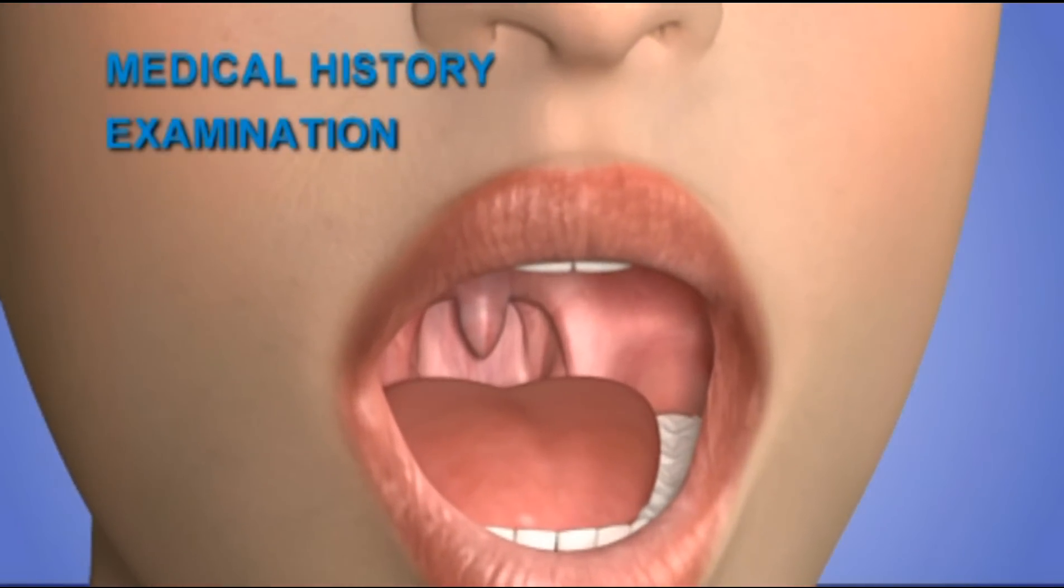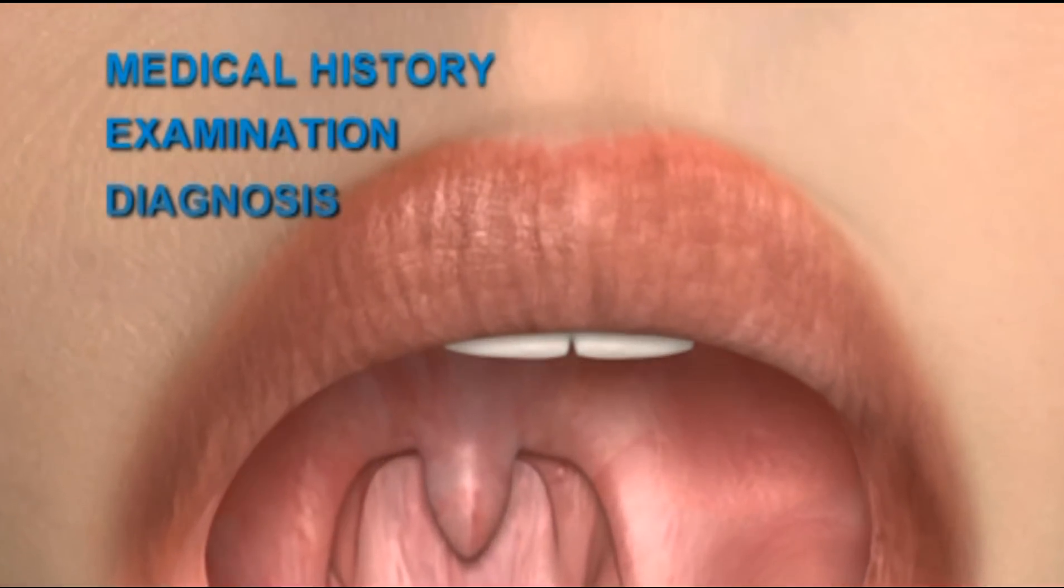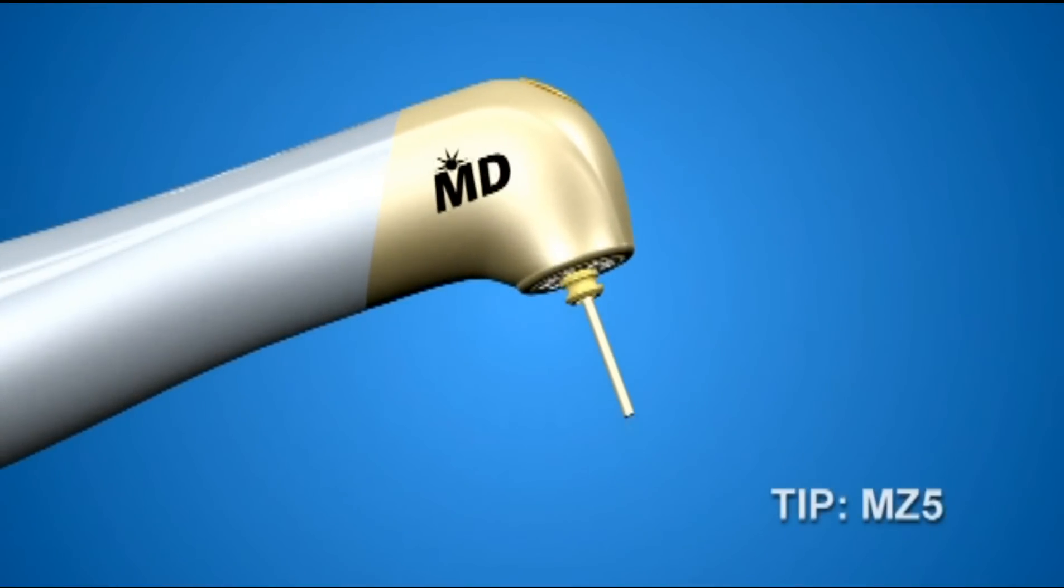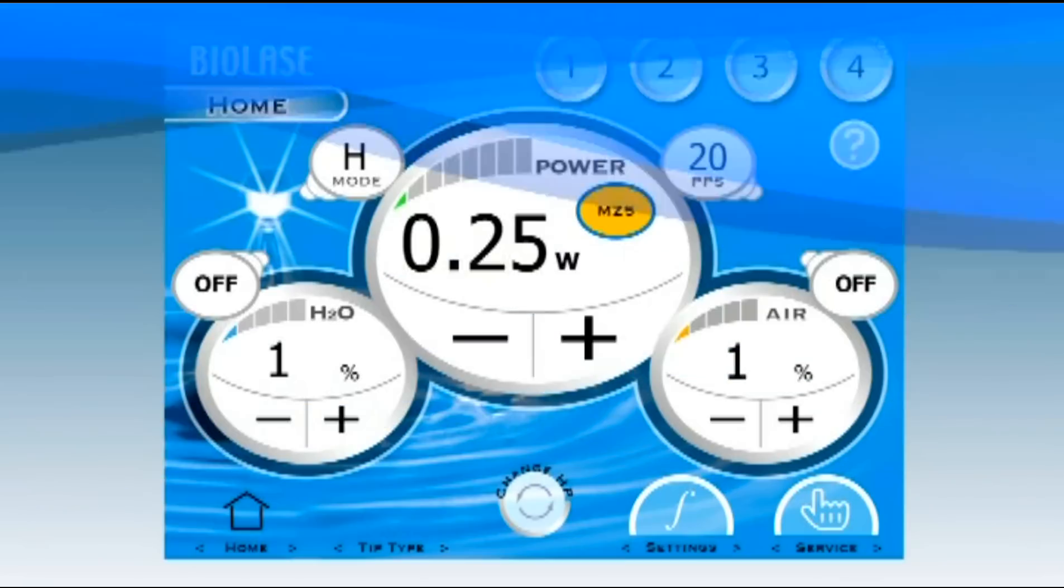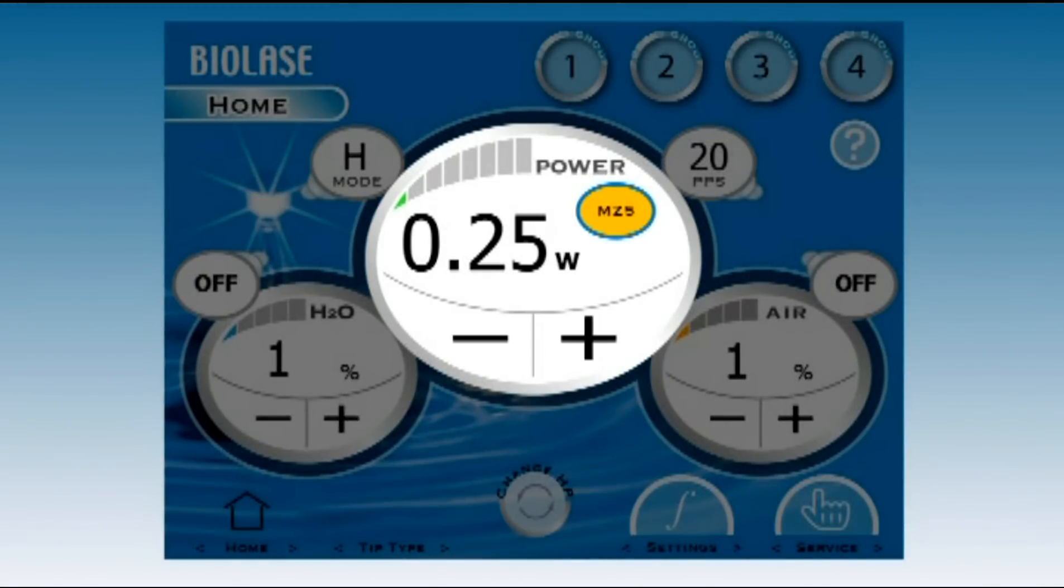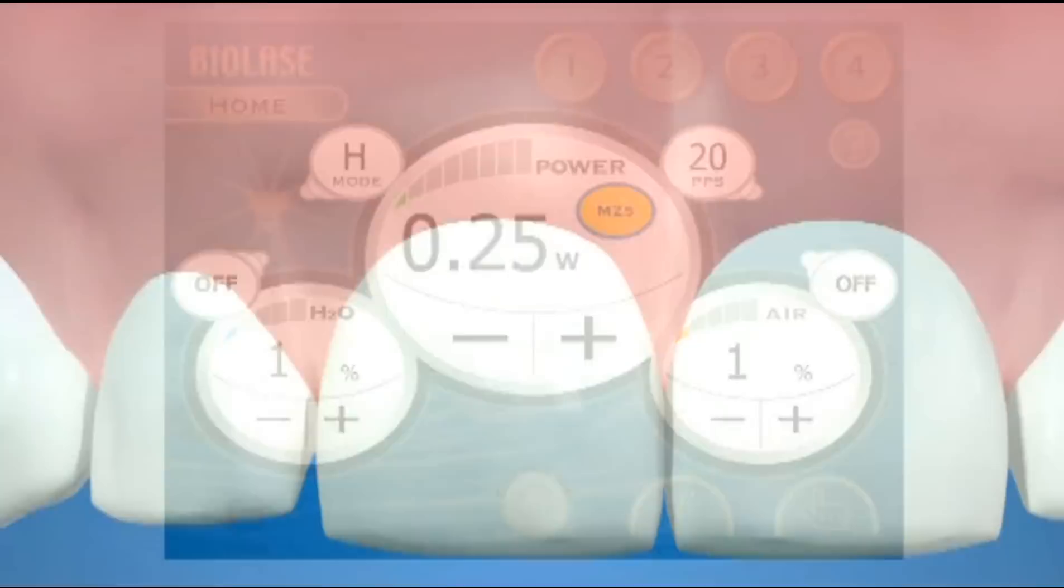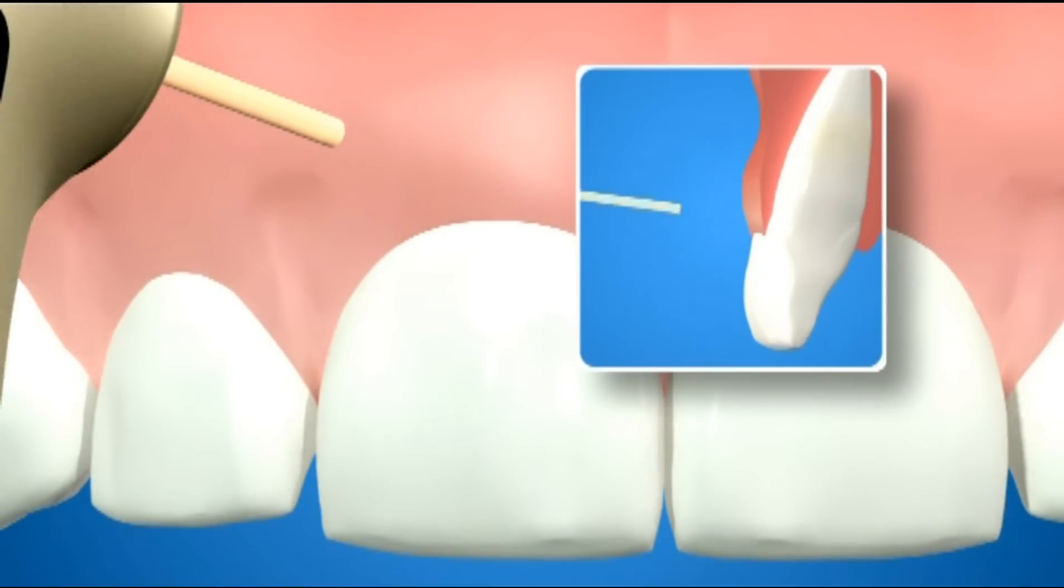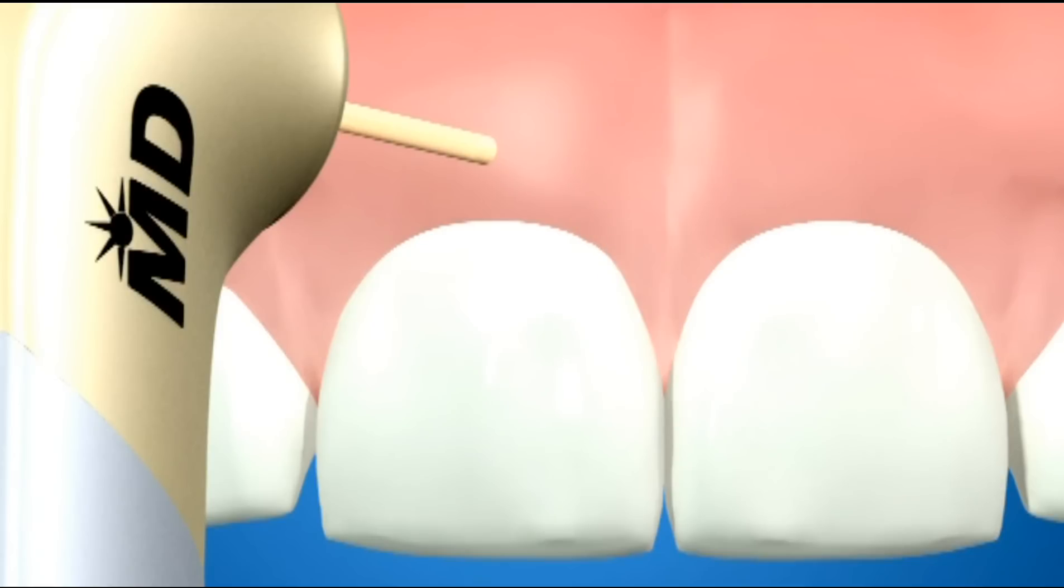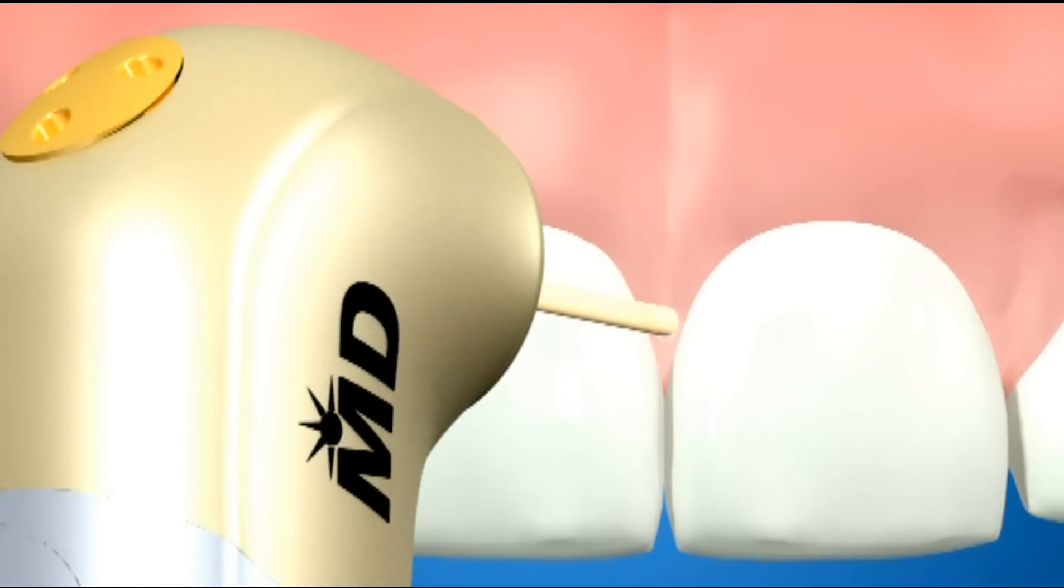After medical history, examination, and diagnosis, proceed with anesthesia. Use the Waterlase MD Gold handpiece and MZ5 tip for this procedure. Start by marking where you want to make your final incision. Set the power to 0.25 watts, frequency to 20 hertz, pulse mode to H, and both air and water to 1%. With the tip 2 to 3 millimeters from the tissue, activate the laser for just a moment to create a mark. Place one dot at midpoint and two other dots at each end of the arch.